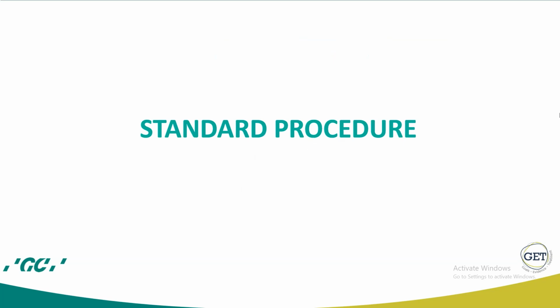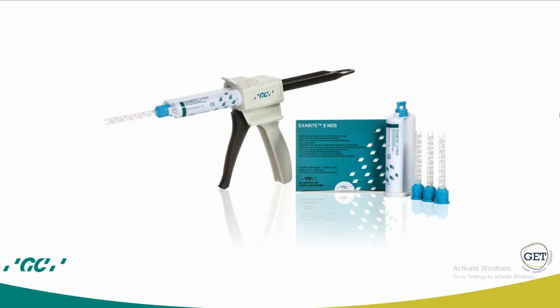Until today, there are multiple techniques to make the bite registration. The easiest way is to apply the bite registration paste with the jaw open slightly and the patient closes into centric occlusion with light guidance by the operator. It is recommended to initially repeat the process without any bite registration material before, to mobilize the patient and get the patient prepared for the final bite acquisition.